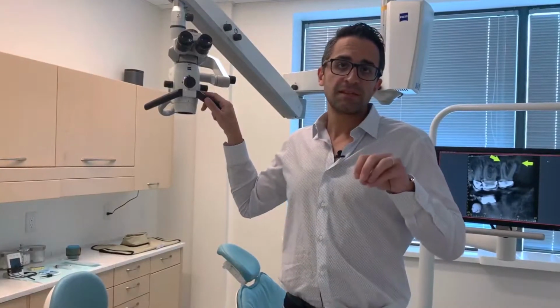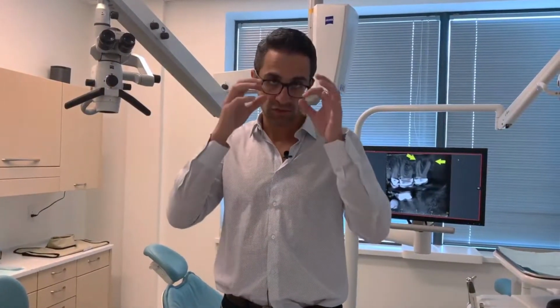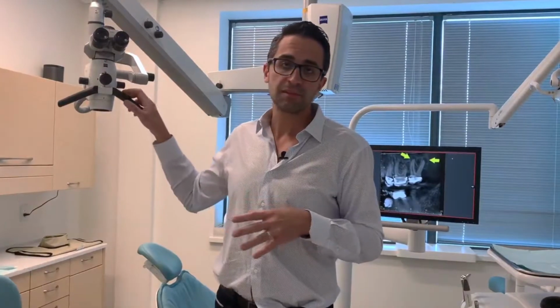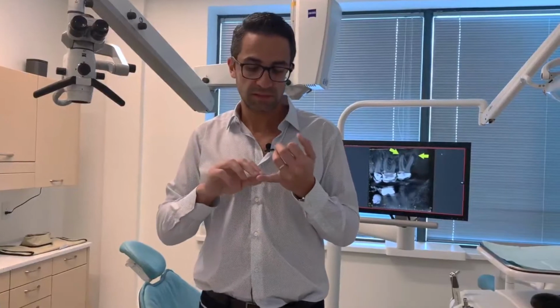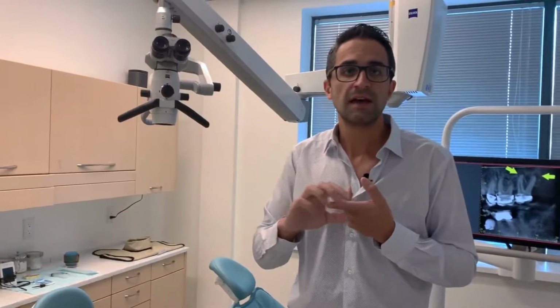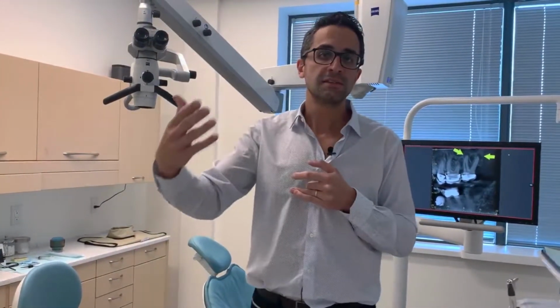This microscope helps us in seeing our field of view much bigger than the naked eye, or much bigger than just regular dental loupes. It helps us see the minute details inside the tooth. For example, to be able to see any missed canals, any calcifications, any posts, any broken instruments. We could take pictures, as I'm going to show you. We could take videos to be able to educate the patient, send whatever we find to the referring dentist, so that we have a clear proof of what the problem is.